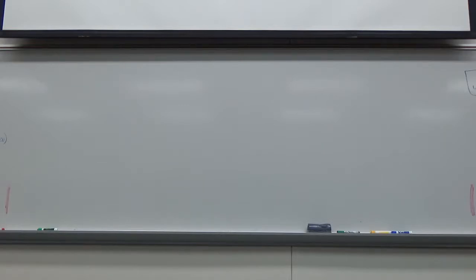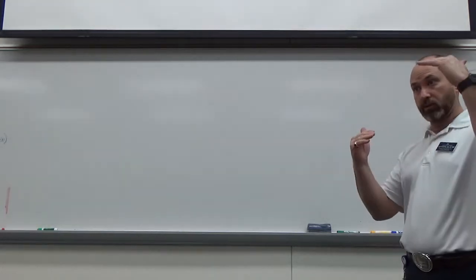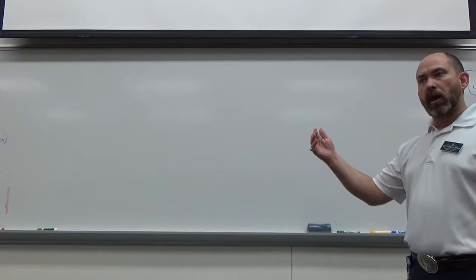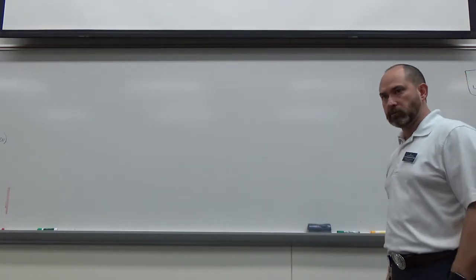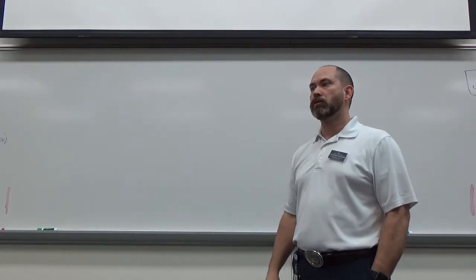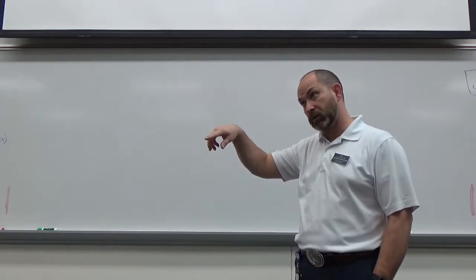Okay, so let's start off with normal. What did normal look like? What does my E wave look like on mitral inflow compared to A? It's larger, so I should have a ratio greater than 1 for the E/A ratio. What else about it? My deceleration time: it goes up and then comes down fairly quickly.